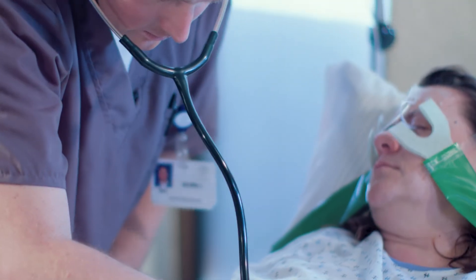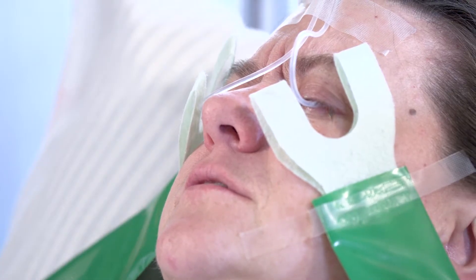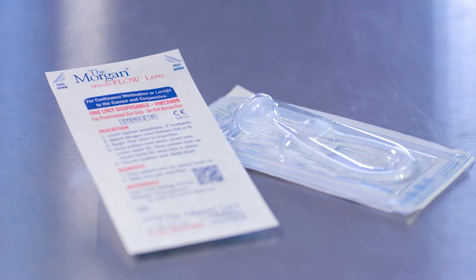Injuries to the eye are different. When a patient comes in with multiple injuries plus ocular trauma — alkali burns, acid burns, foreign bodies, visible or not — the eyes can't wait.